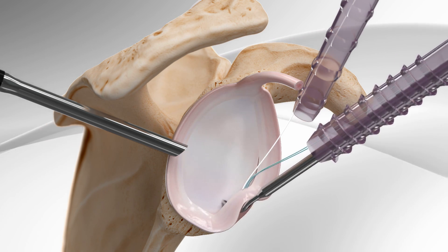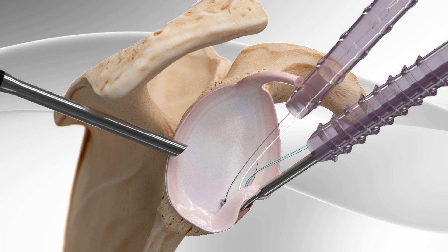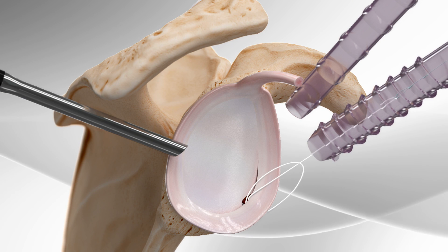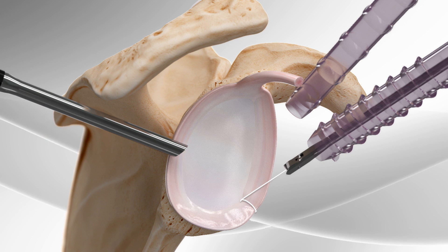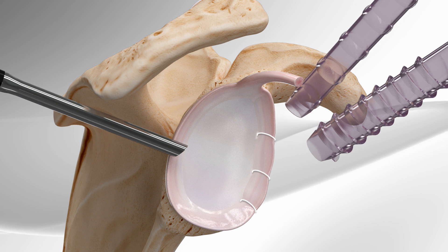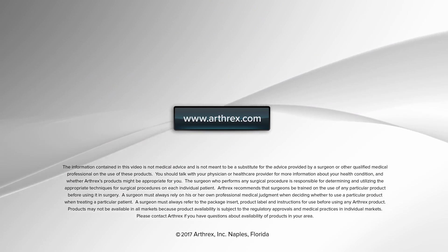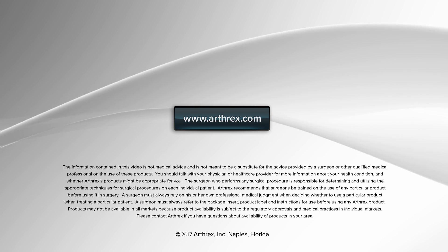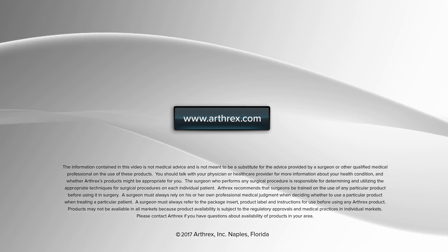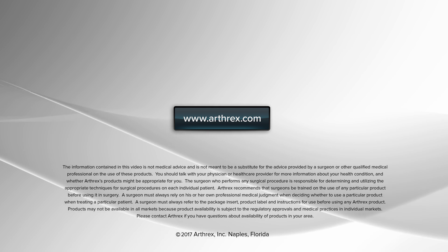Sutures are left in place and passed under the labrum. Finally, they are shuttled into the locking mechanism and the tear between the labrum and the glenoid is closed, completing the repair.